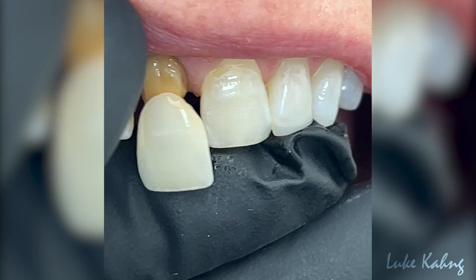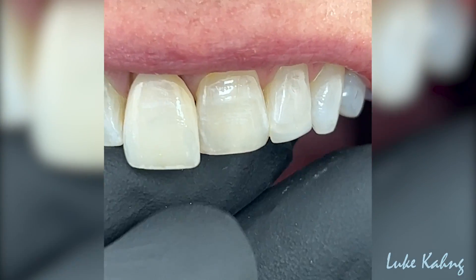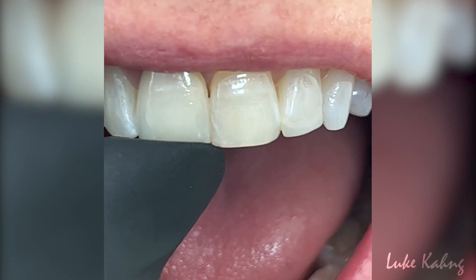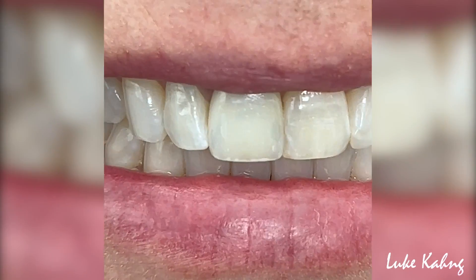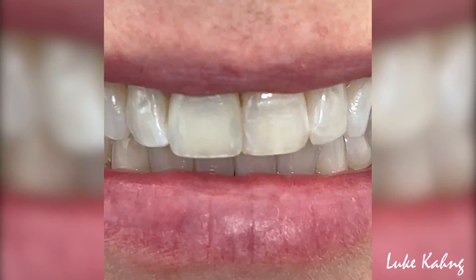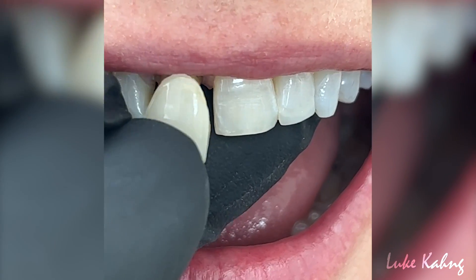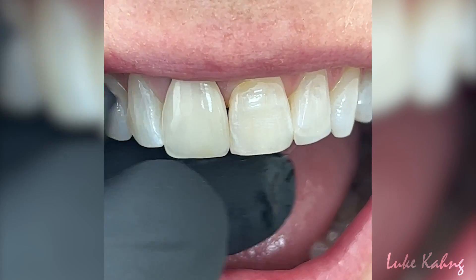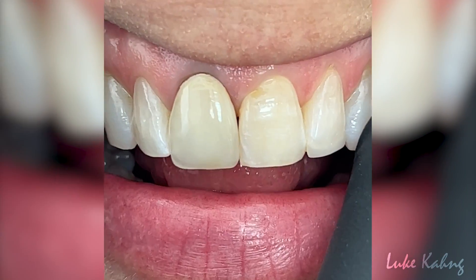This one is the final. Look at this. This one is a try-in, but it's not a match — because not much characteristics between the teeth.